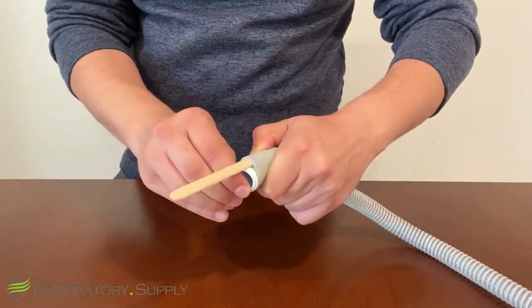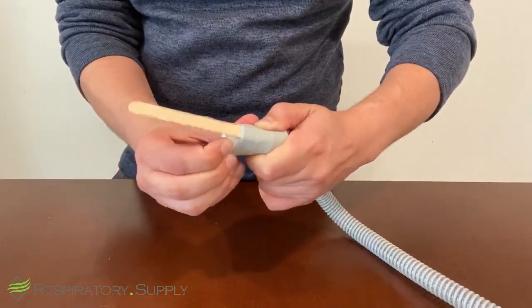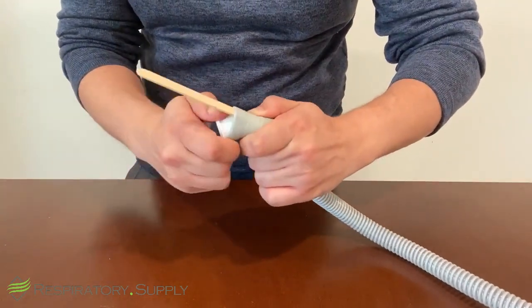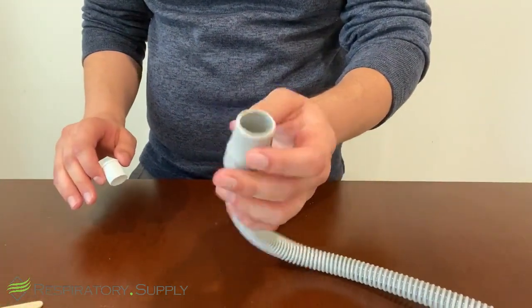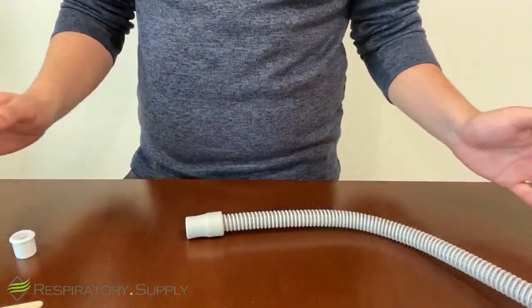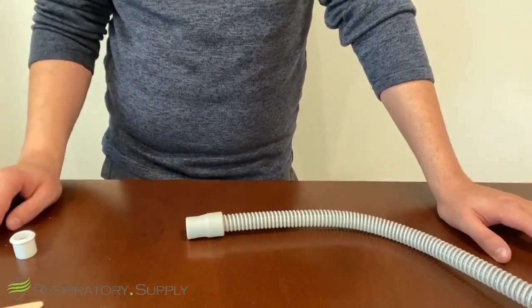Once again, being conscious of the rubber itself, you'll want to pull left to right, and of course, pull away from the popsicle stick. This will allow you to break the seal between the rubber and the plastic here, and then bam, right on out. Remove the popsicle stick, and you can attach your new mask to your tubing. Once again, always be conscious of the rubber. Damaging it will break the seal, and it will make your therapy a lot less beneficial. In fact, you may need to replace your supply sooner if there was such damage.